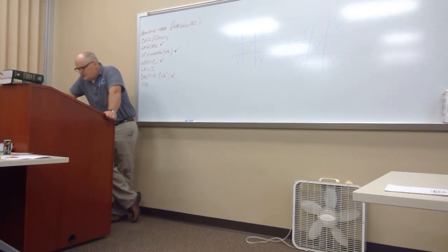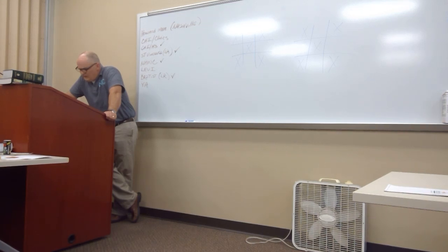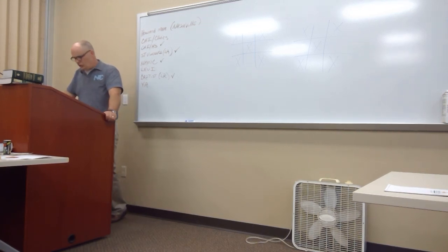Let's see, CSF glutamine, there's one section on that that's important, that answers an objective. This is a very oddball test. I've seen it ordered before, but it'll be a send out. I'm in the right-hand column on 195 under glutamine.